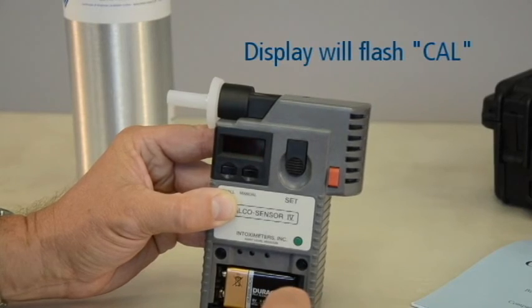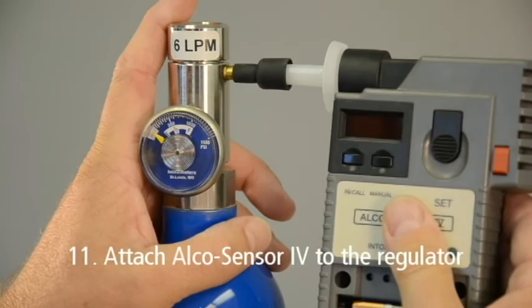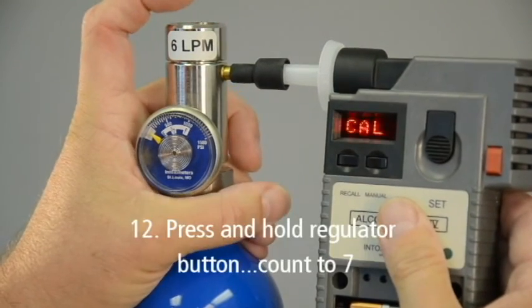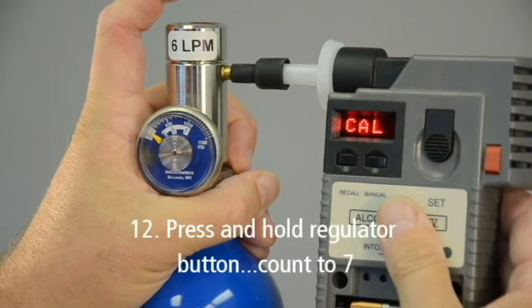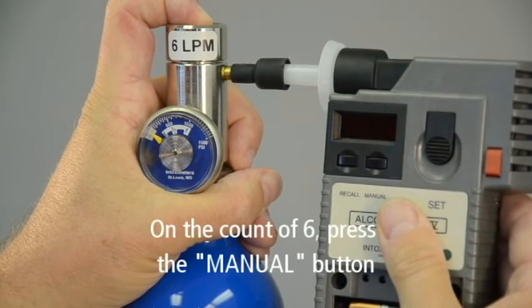The display will flash CAL. Now attach the AlkaSensor 4 and mouthpiece to the regulator. Next, press and hold the regulator button and count to 7. When you reach the count of 6, press the manual button.